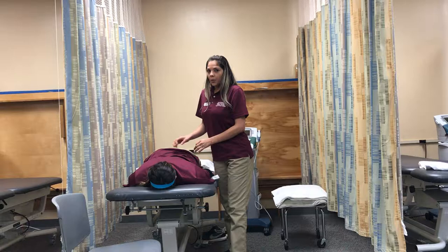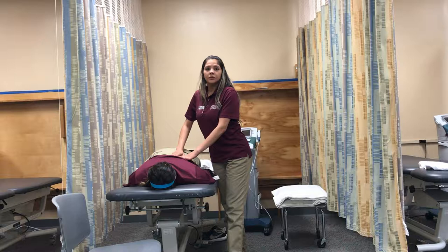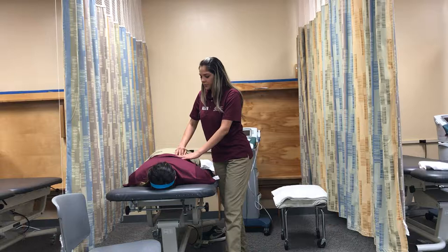I will have to lift your shirt. Is that okay? Yes. Okay, before I start the treatment, I will assess the skin to check for open wounds, redness, or rash. The skin looks good. Do you feel my touch, Monica?